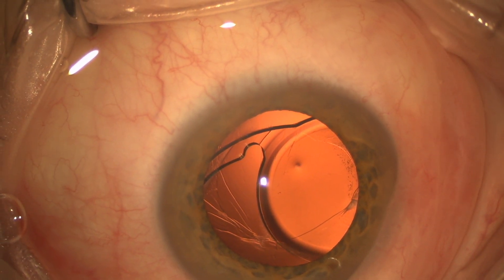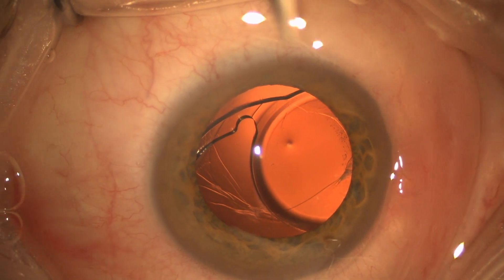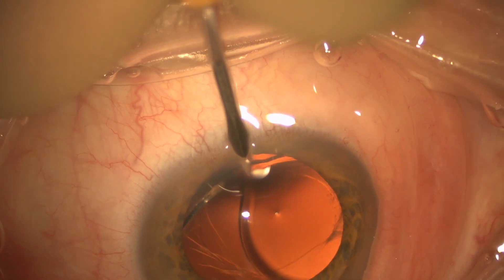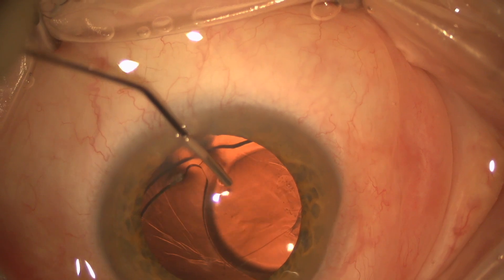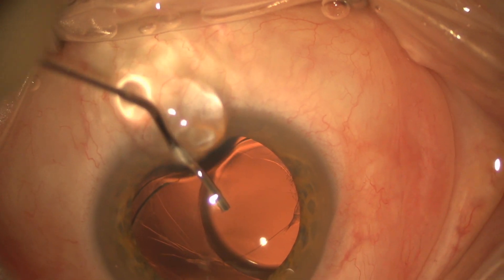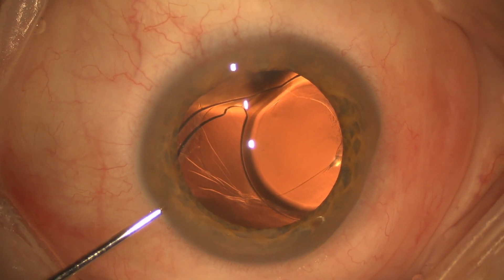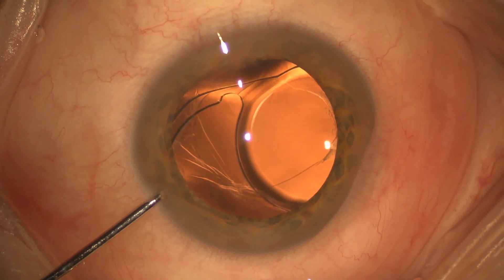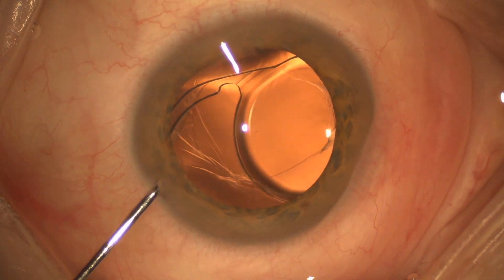This is an unusual case of an IOL that's dislocated actually in the bag. I did the initial cataract surgery several weeks before this. There was no posterior capsular tear or anterior capsular rent during the case, but at the end of the case the IOL did not center extremely well. We tried glasses for this patient, but she was very bothered — you can see that the edge of the optic almost splits her pupil, and she was very symptomatic from this dislocation of the IOL.